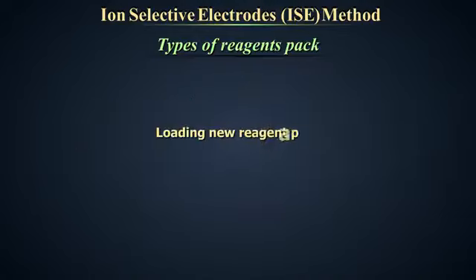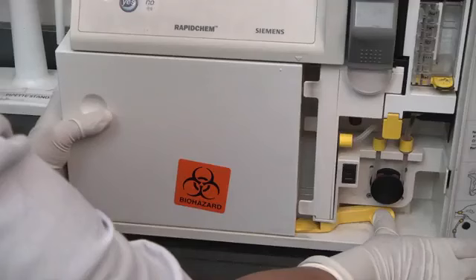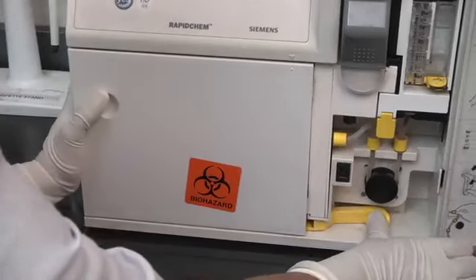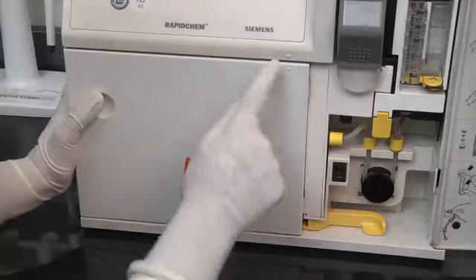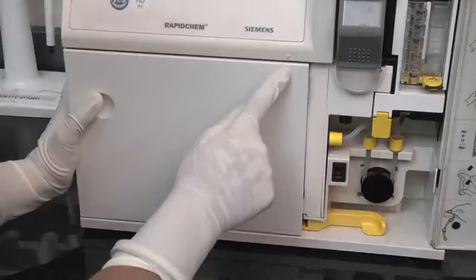To load a new reagent pack, choose the replacement components mode from the user menu. Place the pack in front of the analyzer. Push the module straight back, then firmly to the right to lock it into place against the valve module till you hear a click sound. At this point, the guide arrow should be to the right of the bead on the reagent pack. This method may differ in machines from different manufacturers.